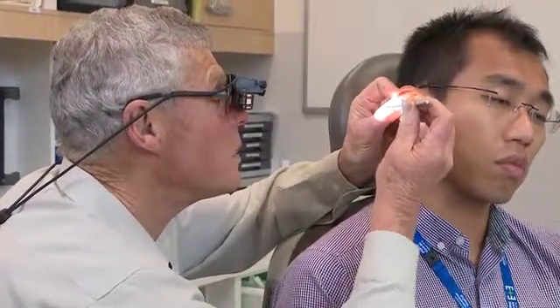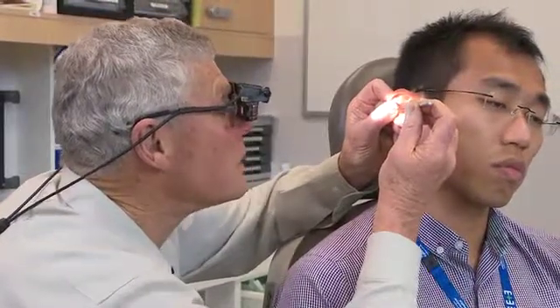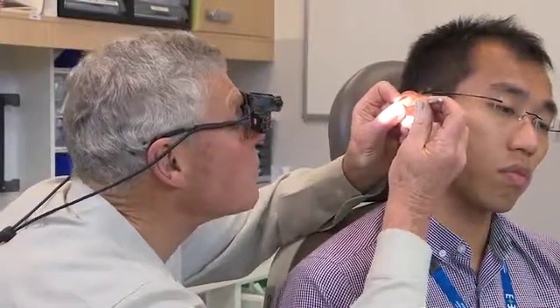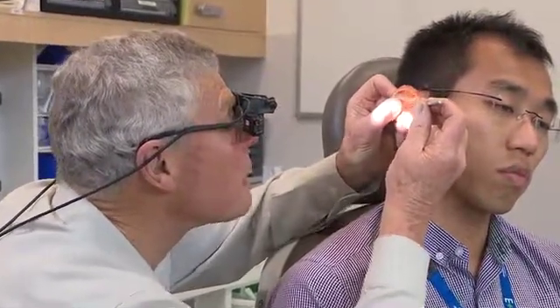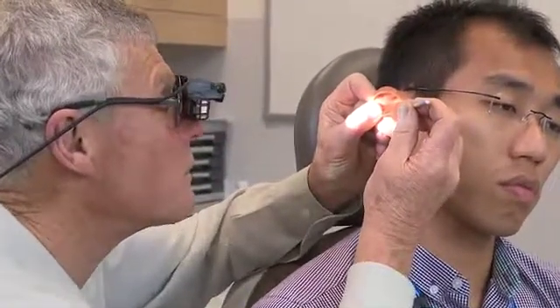You need always to — the books will tell you that you've got to pull in such and such a direction. It's always outwards, and you don't have to have a formula. You look at the eardrum and then realise whether it has to be up more or down more. So forget the formula, just look, and it'll tell you which direction.